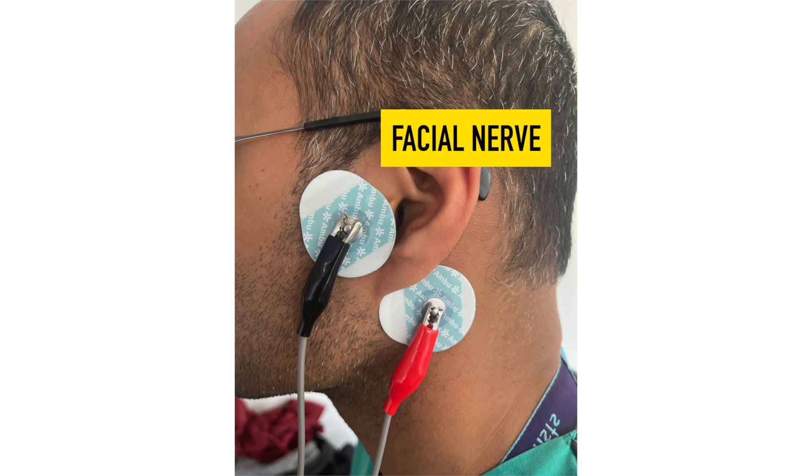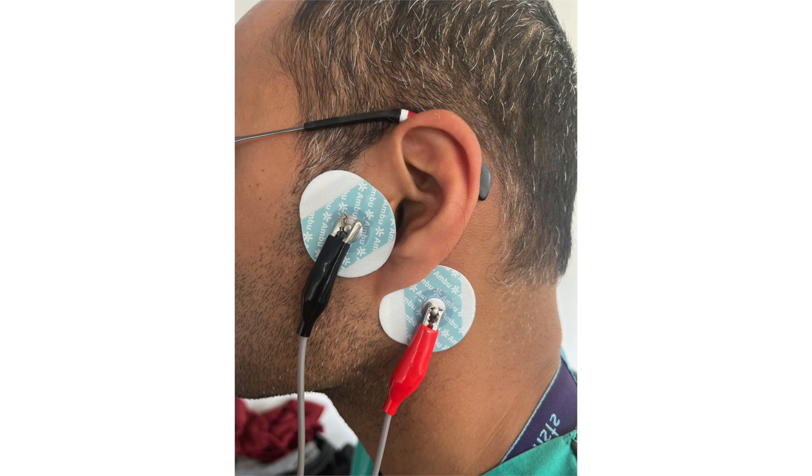The facial nerve: the negative electrode can be placed anterior to the tragus of the ear and the positive electrode can be placed posterior and inferior to the lobe over the mastoid process. However, this site is not recommended for assessment or reversal of muscle relaxation.